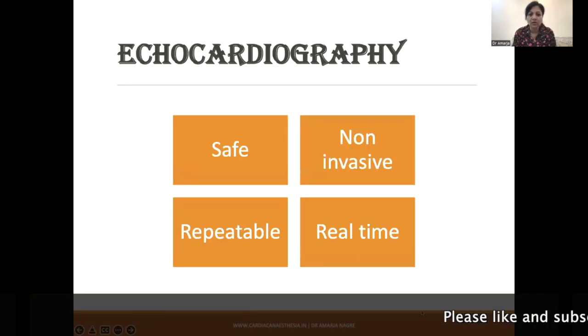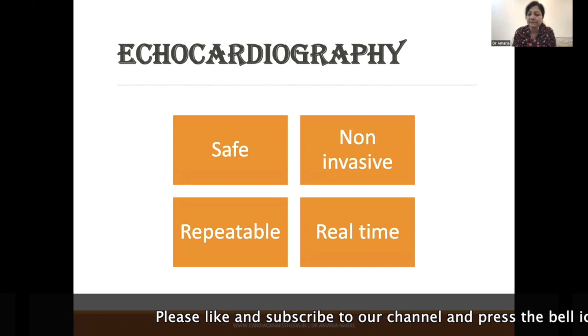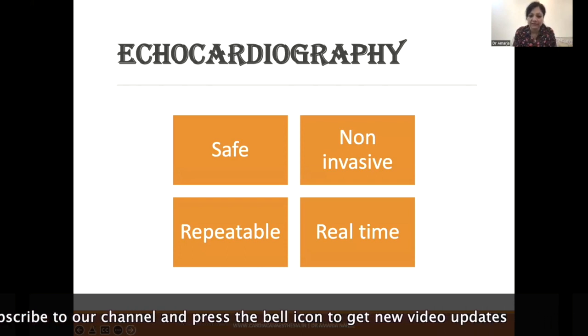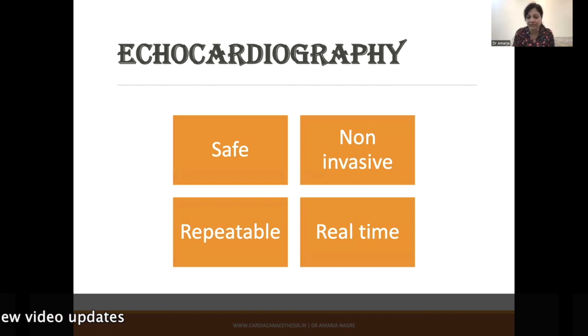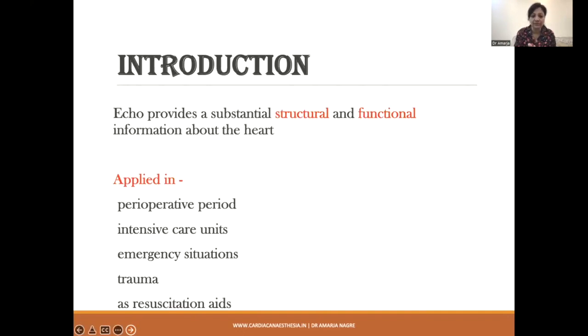So as we all know, echocardiography is safe. It is a very, very safe modality. It is non-invasive. The best part of it is it is repeatable, as many times as you can repeat it, and it is real time. Whatever is happening inside the heart is on the screen, and therefore our management, just like invasive blood pressure monitoring, you manage beat to beat variations, right? And you don't allow your patient to succumb to anything. So is with echocardiography. Echocardiography is real time, beat to beat management can be done.